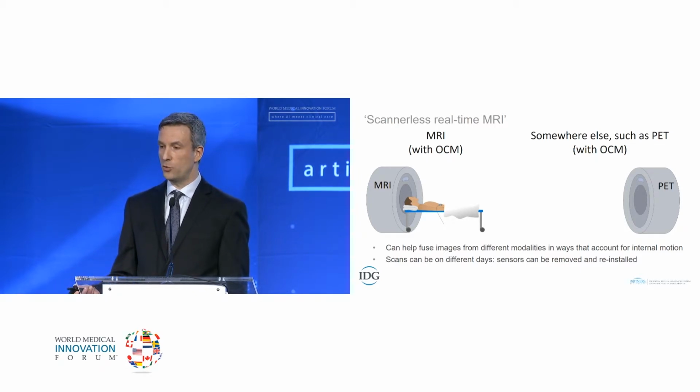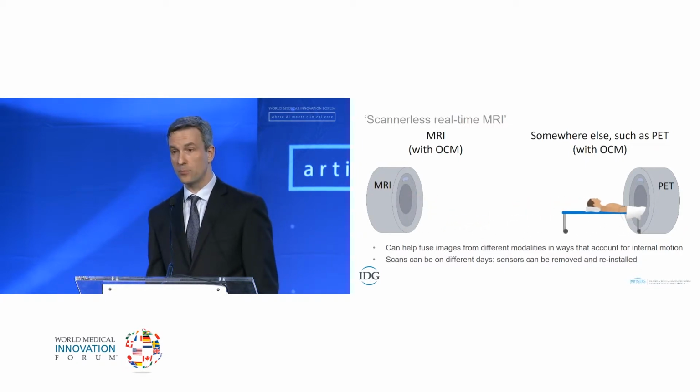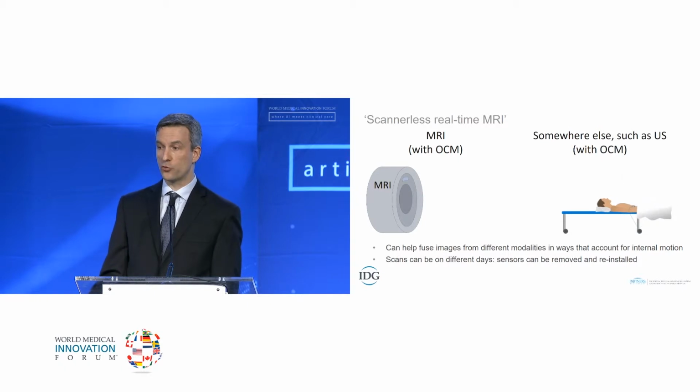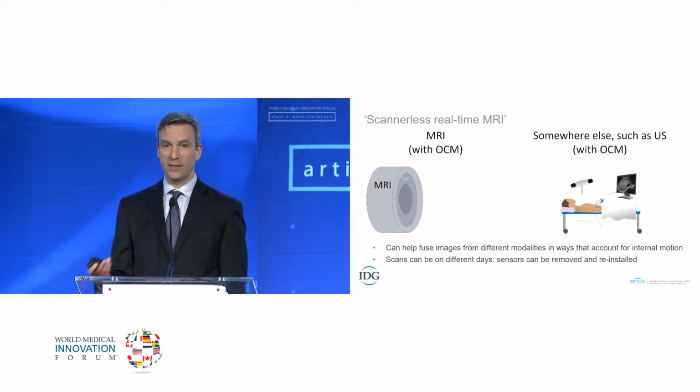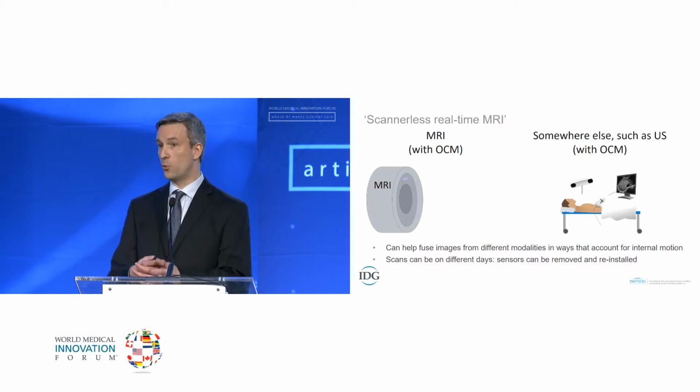And now this ability to make images can follow him or her and the sensors all the way to maybe another imaging exam like PET or ultrasound. And we hope that this capability can help merge images from different modalities in ways that take internal motion into account.